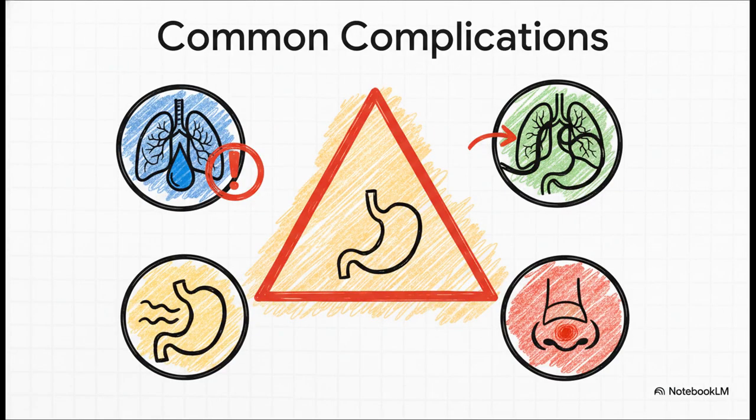And finally, we've got to be on the lookout for complications. The one we all fear most is aspiration pneumonia. It's incredibly serious, and it's exactly why our technique has to be perfect. But you also need to watch for other things, like the tube getting dislodged, the patient feeling sick, or even just a little pressure sore on the nose from the tape. Knowing the risks is the first step to preventing them.